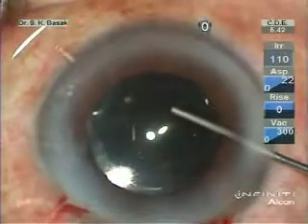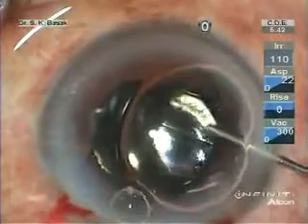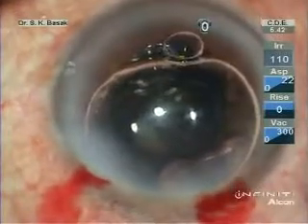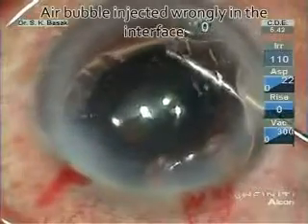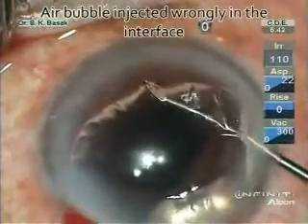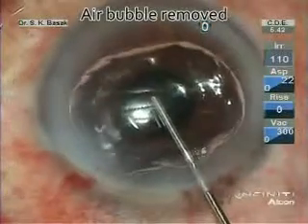Air bubble was injected from right hand side port. Unfortunately, it went into the interface and was detected immediately. That air bubble was removed.